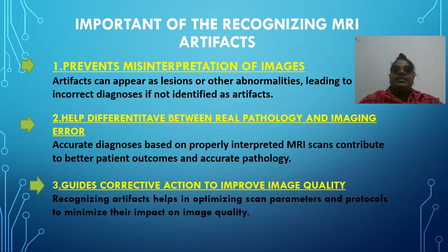And finally, it guides corrective action to improve the image quality. As you can see, recognizing artifacts helps in optimizing scan parameters and protocols to minimize the impact on image quality.